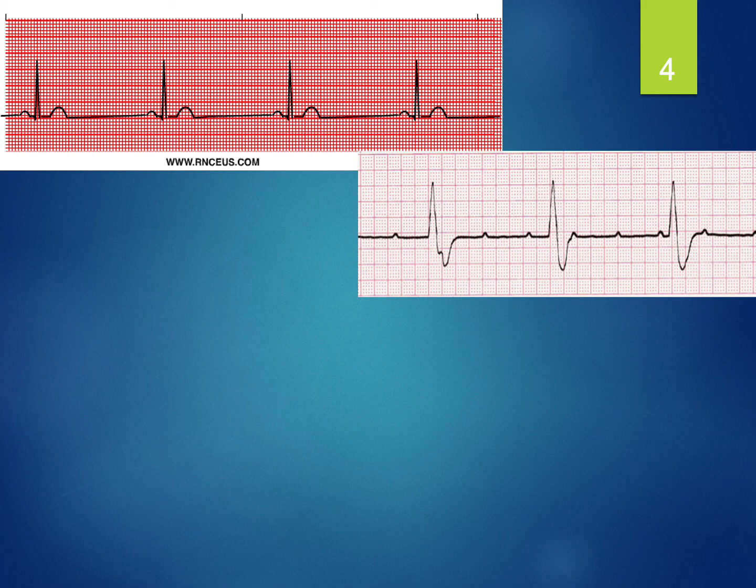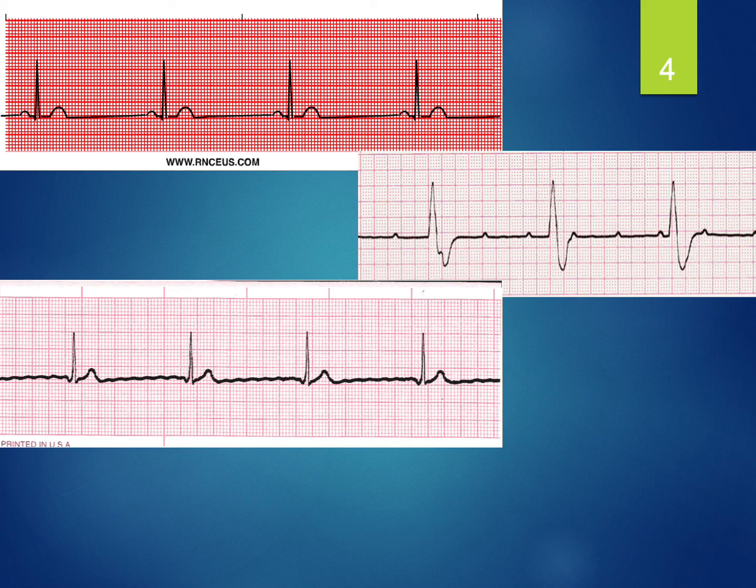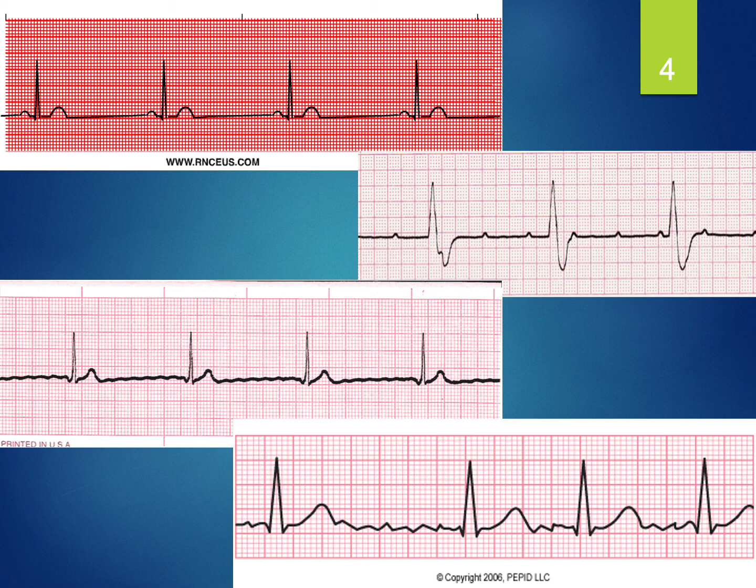Now what about junctional rhythm? Remember, the intrinsic pacemaker of the junction is naturally slower. So if my patient were in this junctional rhythm, then I might see symptoms of low cardiac output. And even atrial fibrillation here. Now, much more likely than not, AFib is going to be a faster rhythm, sometimes uncontrollable with a rate of over 100.